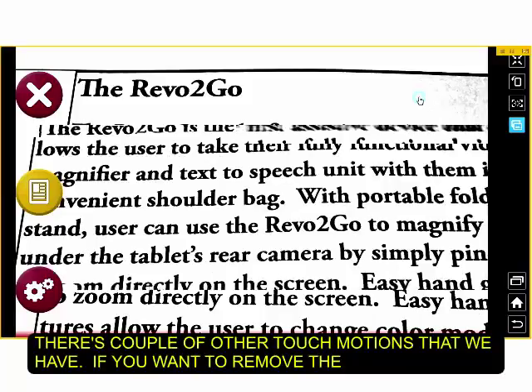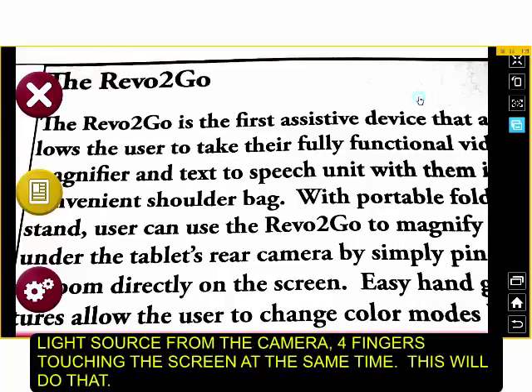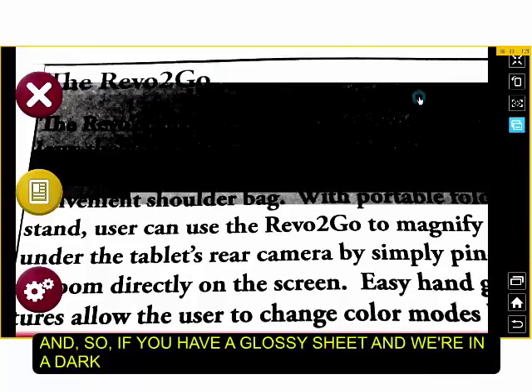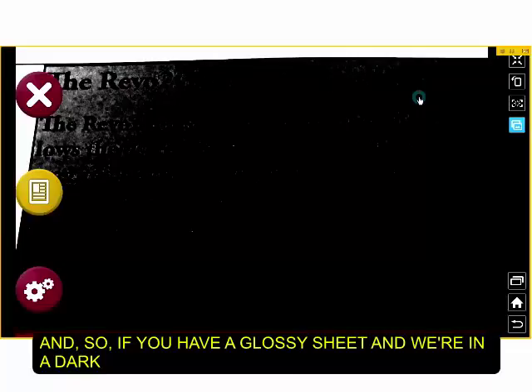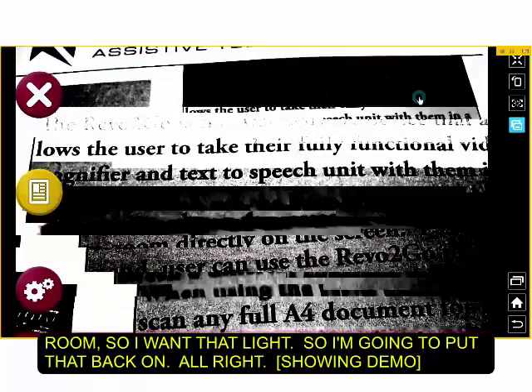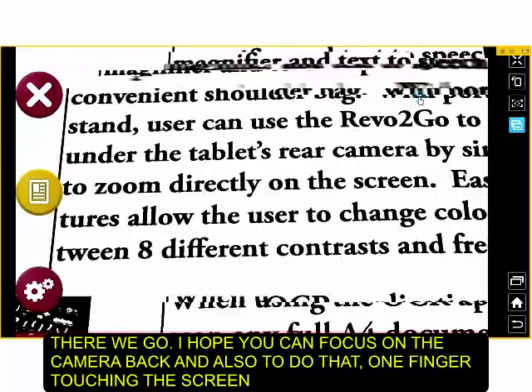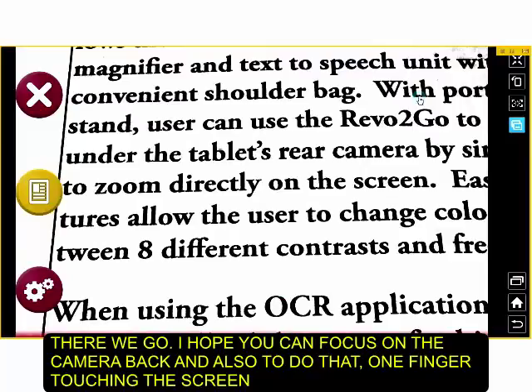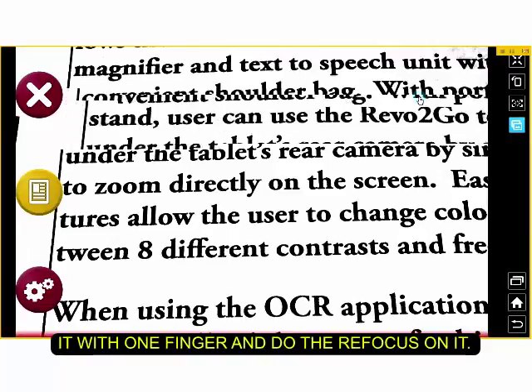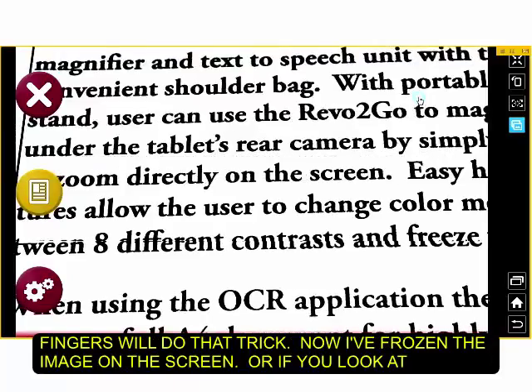There's a couple other touch motions that we have. If you want to remove the light source from the camera, 4 fingers touching the screen at the same time, we'll do that. So if you have a glossy sheet, and we're in kind of a darker room, so I do need that light, so I'm going to put it back on. All right. There we go. And let's get the focus on the camera back. And also to do that, 1 finger touching the screen will refocus the camera. So if it's out of focus, they just simply touch it with 1 finger, and then it will refocus on it. Now from here, if I want to freeze the image, 5 fingers will do that trick.